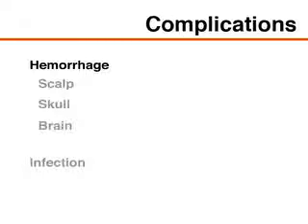Hemorrhage can occur at any stage of the procedure, but is seldom clinically significant. Before the procedure, identify and correct any coagulopathy. A scalp or skull hemorrhage usually terminates once the bolt is placed, but skin sutures and bone wax may be applied if bleeding persists. Intracranial hemorrhage is rare, but unenhanced CT of the head may be performed after the procedure if hemorrhage is suspected.